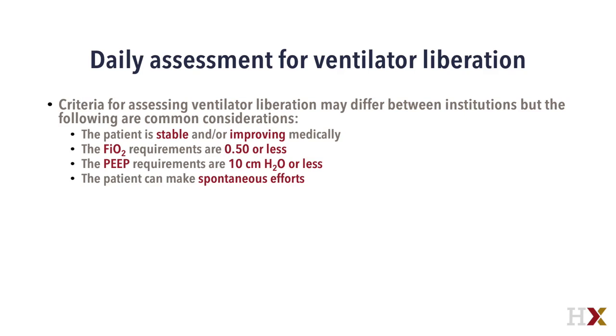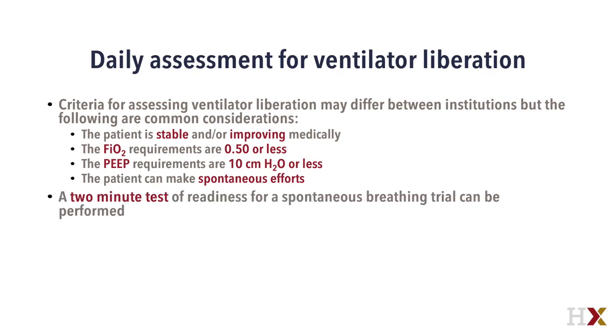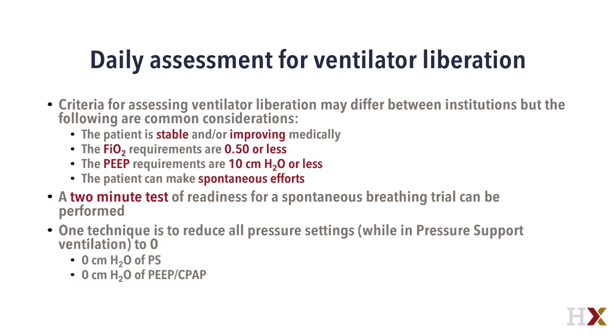If they meet this criteria, a 2-minute test of readiness for a spontaneous breathing trial can be performed. One technique to assess readiness is to reduce all pressure settings while in pressure support ventilation to 0.